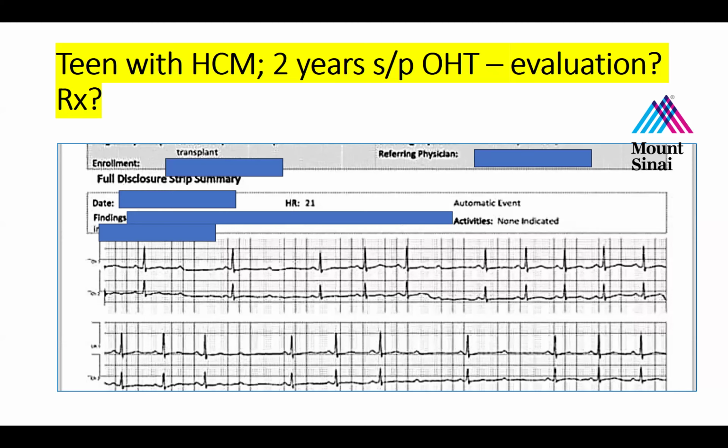Okay, so now he's in the hospital, and you're getting tracings like this, maybe even seeing a handful where there are some longer pauses. By the report of the person who told me about this case, who was actually the patient themselves, there were 7-second pauses intermittently. So very concerning. I would want to do a cath and biopsy to make sure, especially if this is new as far as we know, that it's not a sign of rejection.